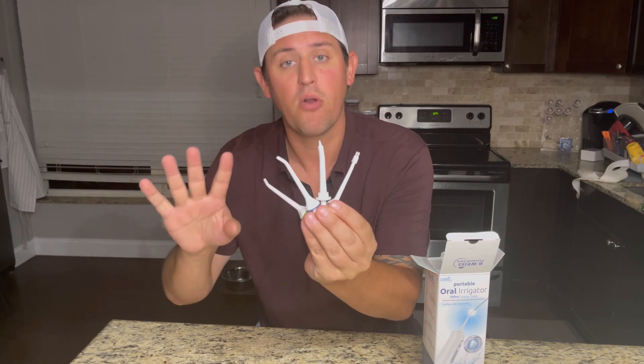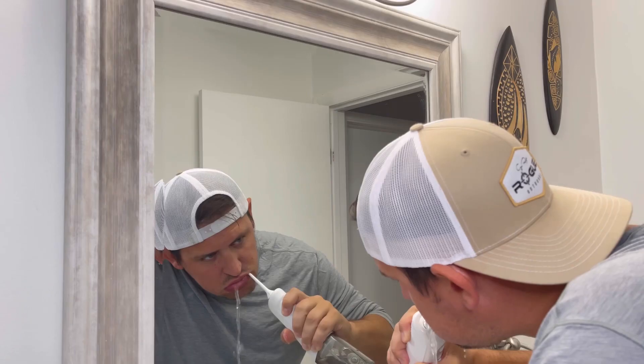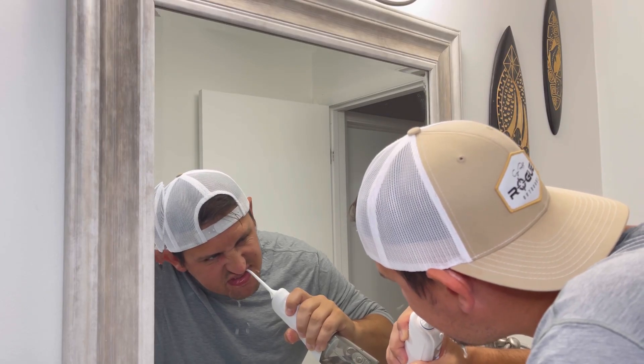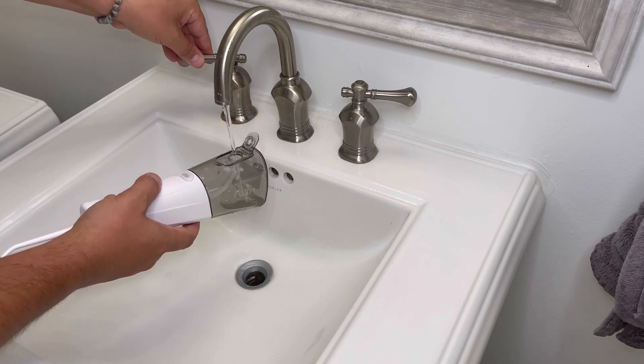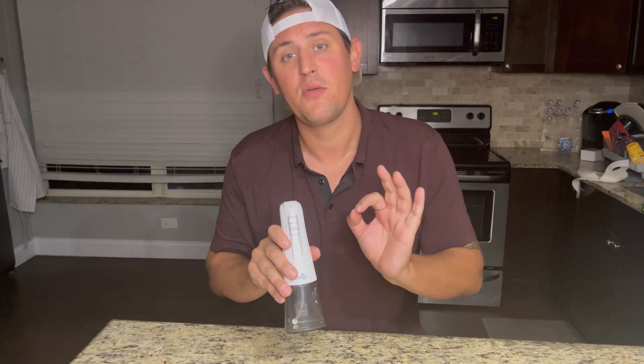Four different tips for the water flossing, each one suitable for a different mode of flossing. Last but not least, we have the actual flosser — professional charging, IPX waterproof design, 300 milliliter water tank, and of course the four working modes, depending on how you want to clean.